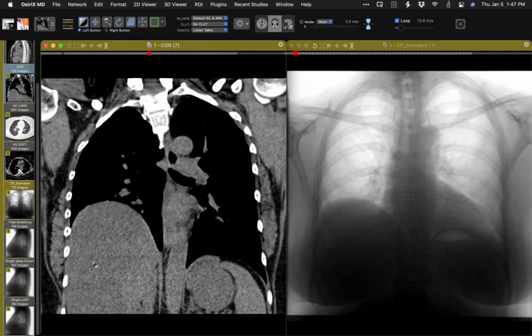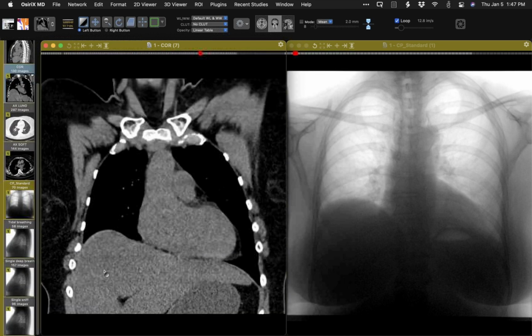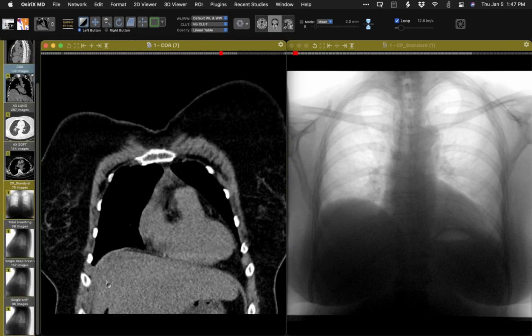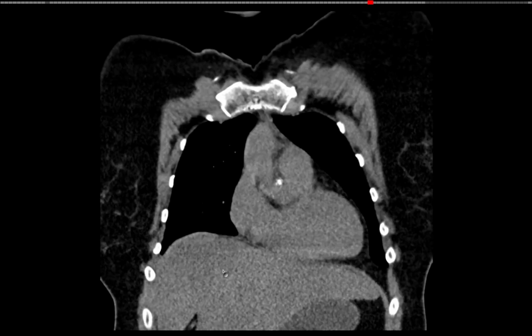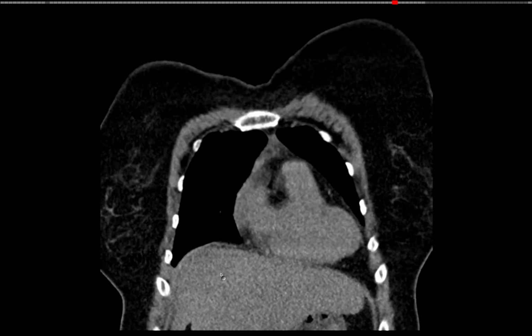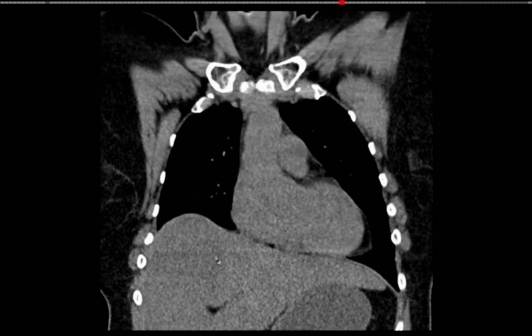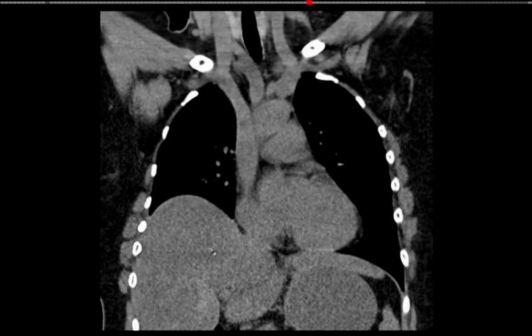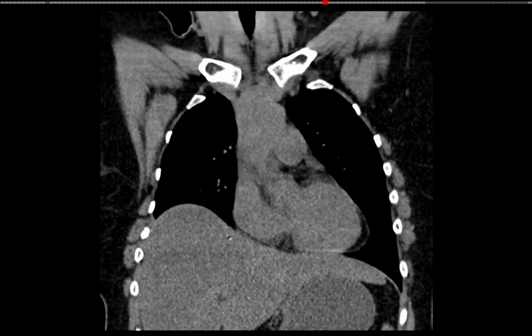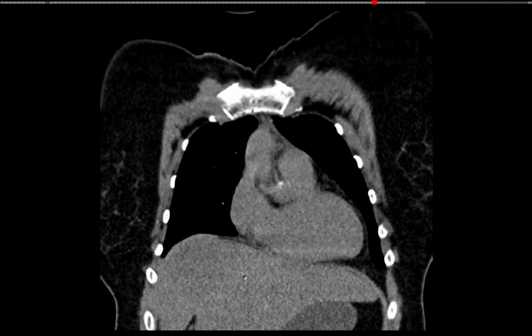So if you go anterior, please, on the CT. Okay, so one of the things about eventration is that as you get medially and start to go underneath the heart, eventration will return to normal height, whereas paralysis will let the diaphragm really be elevated all the way across to the left side. But if you have eventration, you'll see this peak, but you'll see a return to normal height medially, just below the right atrium and cava there.